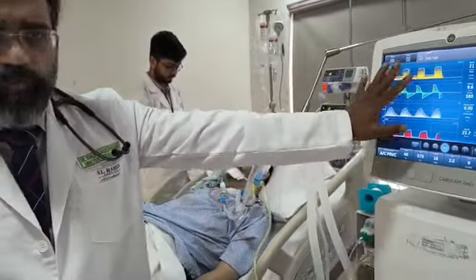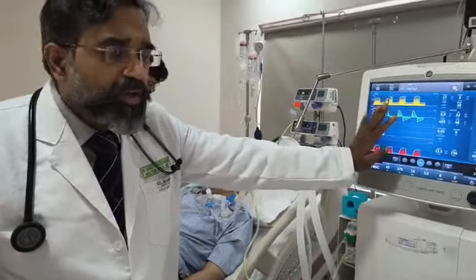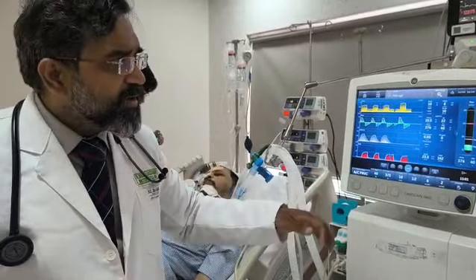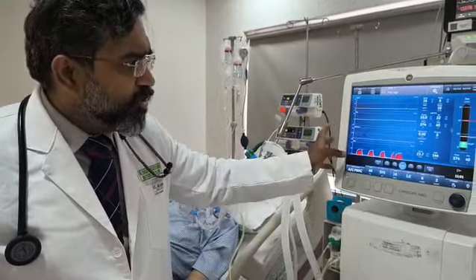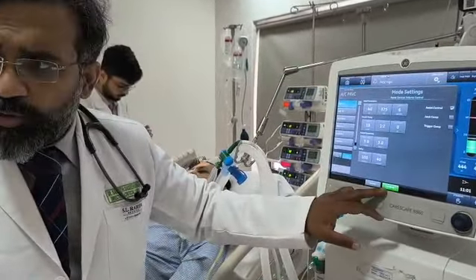So we accept that flow artifact because it is not causing any hemodynamic embarrassment. It is not causing any harm to the patient. It is a flow artifact on the ventilator. Over a period of time, we'll see how this gets better. Once we convert to volume control or pressure control, this will go off. Let's see what happens if we convert to volume control. The flow artifact should ideally go.